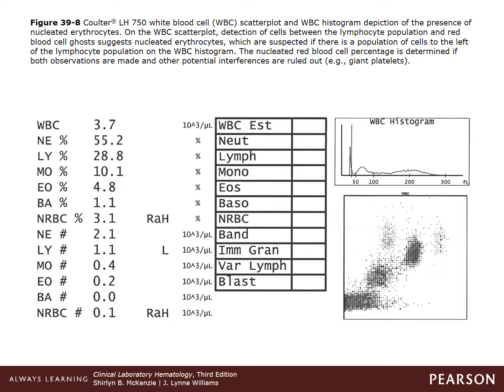Now the WBC scatter plot below uses optical light scattering principles, so each of these dots represents a cell within the group, and as blood passes through a laser or optical beam of light, they create a forward scatter and side scatter that determines the complexity and measurement of the cell. So you can see this first group here are lymphocytes, and now behind this you can't see basophils, but in the 3D image they're colored and you will be able to visually see them.